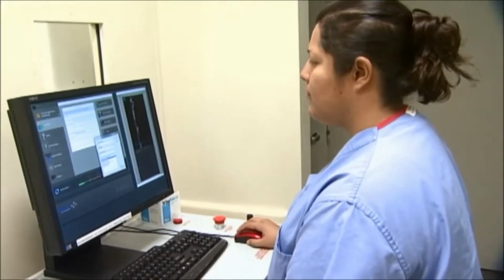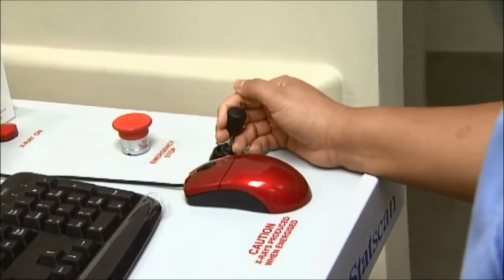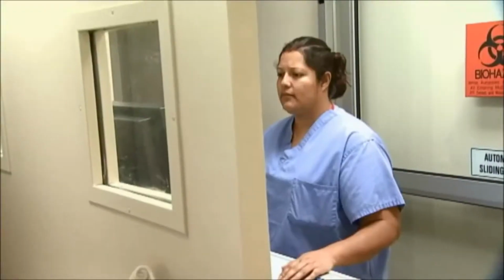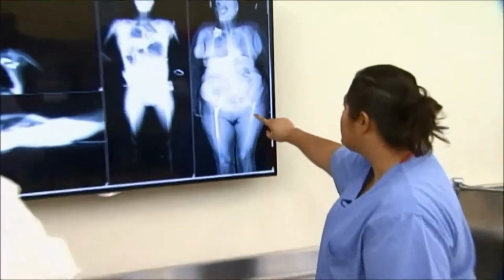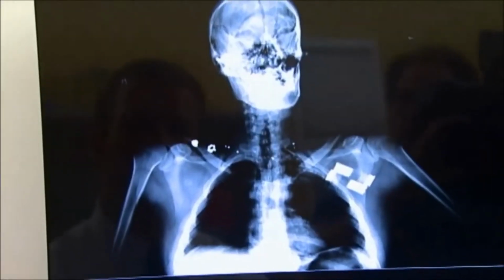The Lodox scans can pinpoint the exact location of a bullet, helping determine the cause, manner, and mode of death, while often finding things no one knew they'd even find. Things like artificial implants with traceable serial numbers, which makes identifying a body easier. So in a very complicated case with multiple gunshot wounds, sometimes if we don't find the bullets when we're doing the autopsy, we'll send the body back to X-ray. A few seconds later, body's back.